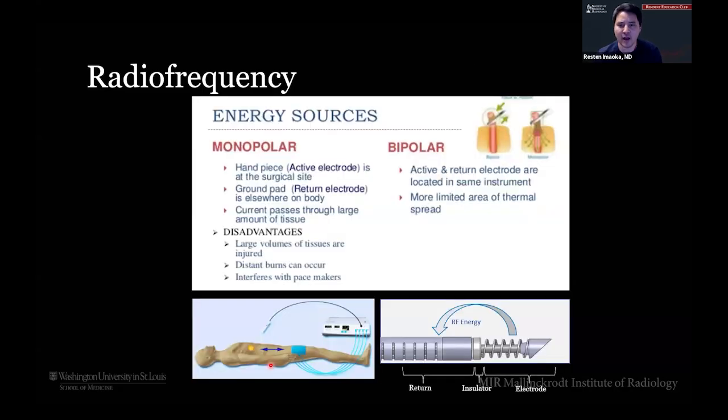When we talk about how it works, we still occasionally do see people that are using monopolar devices with RF. But really, when it comes to tumors, the bipedicular approach, the main hitters are all bipolar, where you've got an active and return electrode in the same instrument. And that limits the area of thermal spread, but notably does not have the disadvantages of monopolar, which are large volumes of tissues that get injured, distant burns, especially at your grounding pads if that's not appropriately put on. And then also, monopolar can interfere with pacemakers too, right? So bipolar for tumors, essentially everybody is using these now.